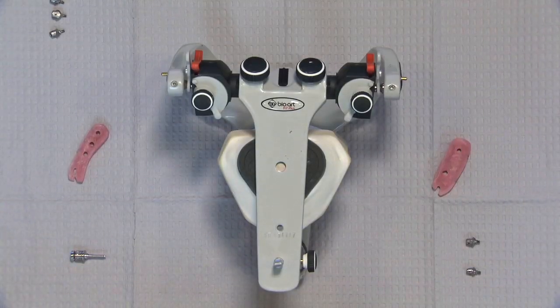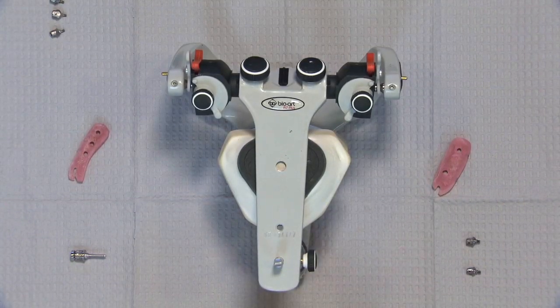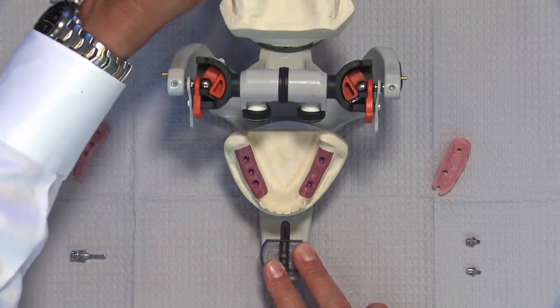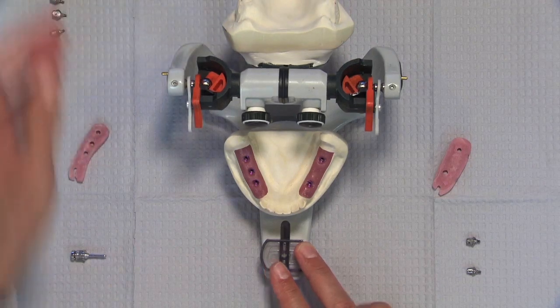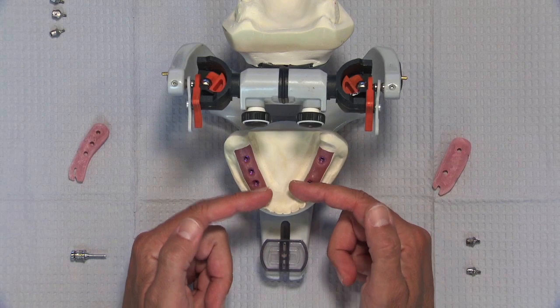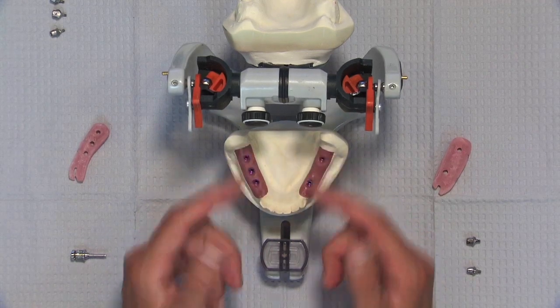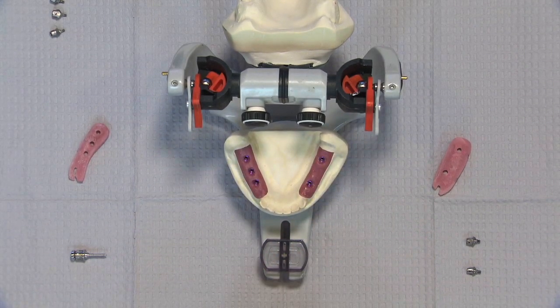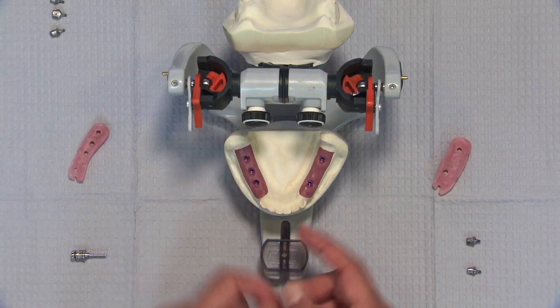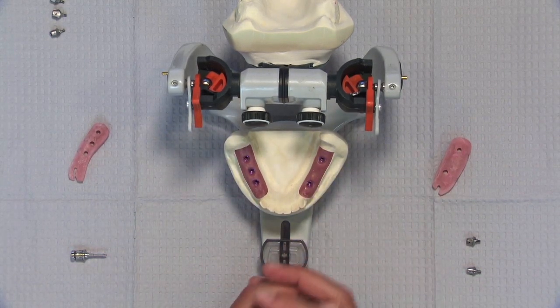On this week's Case of the Week, we're going to talk about a common issue that we see in our implant department, and it relates mainly to Kennedy Class 1 and Class 2 cases. If you forgot the Kennedy classifications, that's certainly understandable. A Class 1 is where we have bilateral edentulous space, and a Kennedy Class 2 is where we just have, for example, a unilateral edentulous space, as if we still had teeth over on this side.